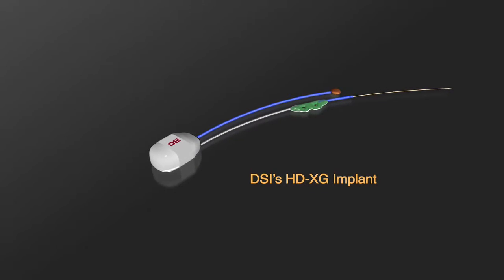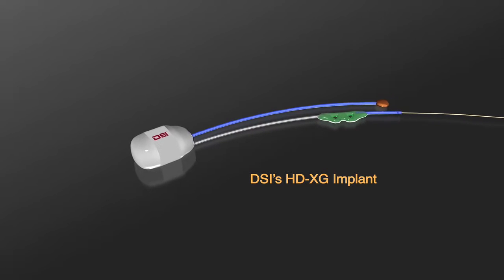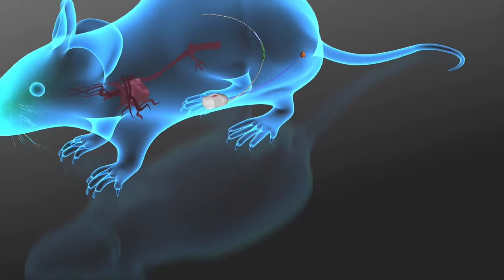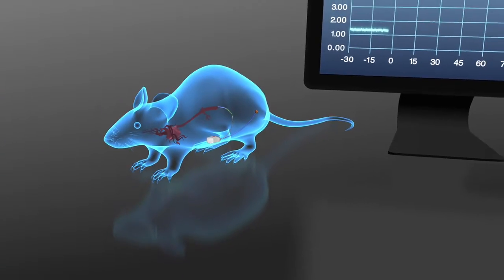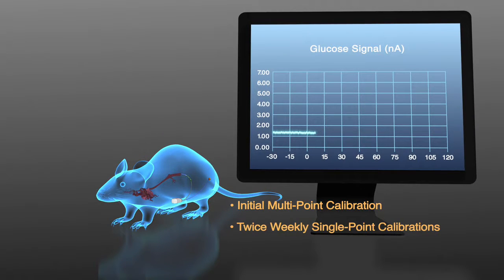The XG implant provides continuous measurements of blood glucose, temperature, and activity in laboratory animals. To ensure optimal performance, the XG must be calibrated using reference measurements over the course of a study. We will introduce multi- and single-point calibration procedures to you.